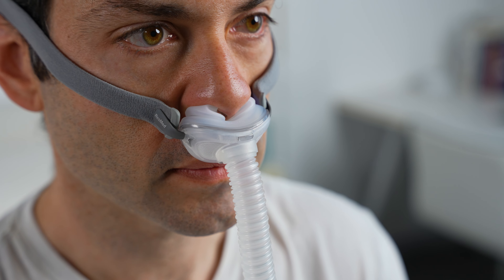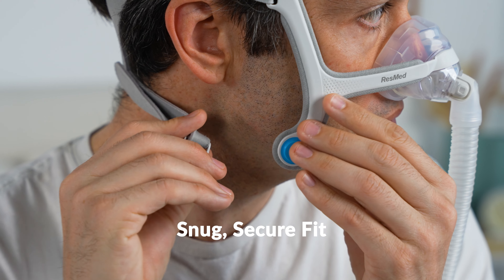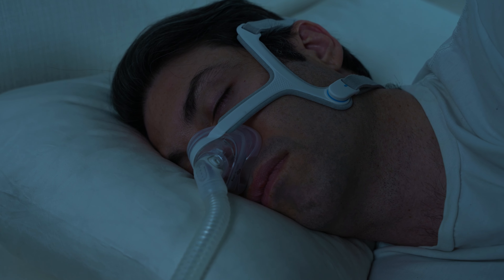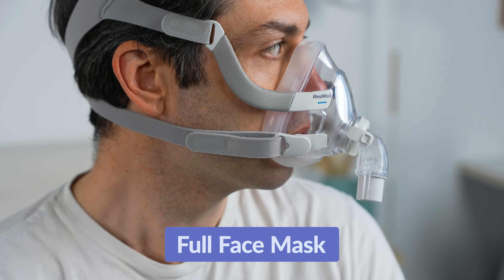Let's examine the benefits and challenges of the standard nasal mask. Unlike the nasal pillow mask which pushes air directly up your nose, or the nasal cradle which sits under, this mask circulates air around your nose, making it better for higher pressure settings. It provides a snug fit, especially with more straps, which helps prevent movement during the night. The challenges are that the head straps can feel cumbersome, it can leave red marks on the face from the straps, and may cause sensitivities on the bridge of the nose. This mask is ideal for individuals who require higher pressure settings and prefer minimal mask contact on their face.